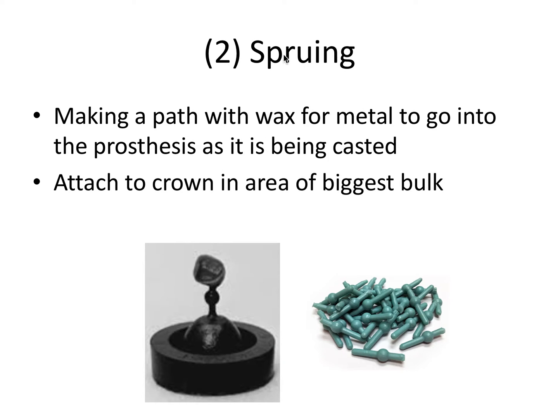The second step is spruing. This involves making a path with wax for the metal to go into the prosthesis as it's being created. These are pre-made wax sprues, and you want to attach the sprue to a base and then attach it to the crown in the area of biggest bulk — usually at a cusp or incisal edge.